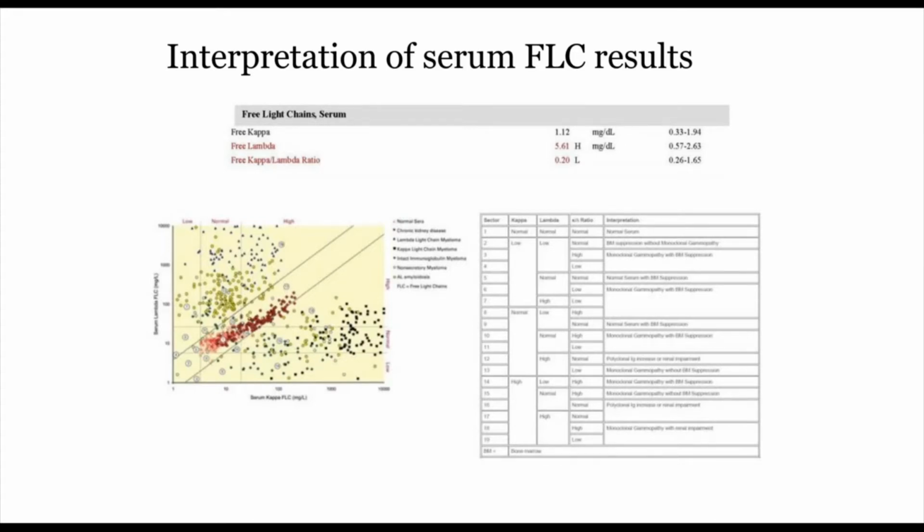Thank you so much. And what platform was used to run the Freelight assay? Was it run on Abbott? Actually, the plus and the minus of the Freelight assay is that the binding site actually controls specifically what instrument it's run on. And now that we've run it on the Abbott instruments, I think it kind of makes sense.